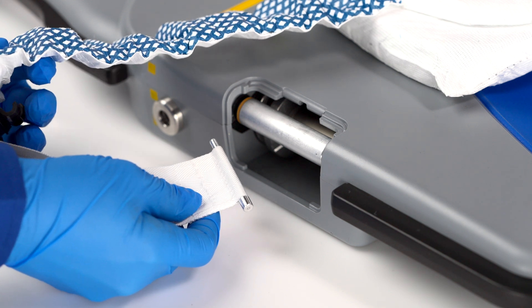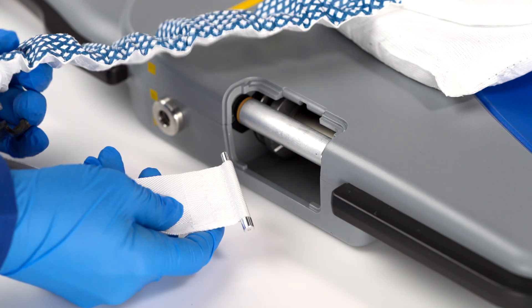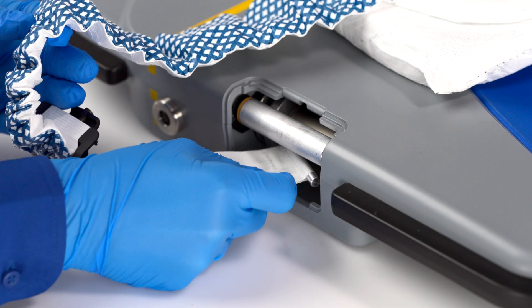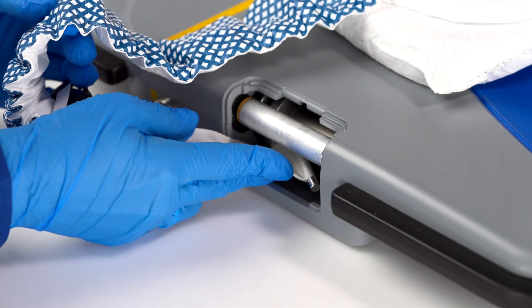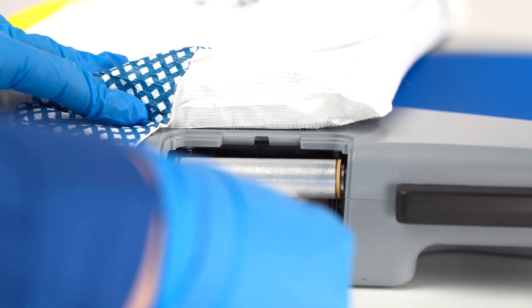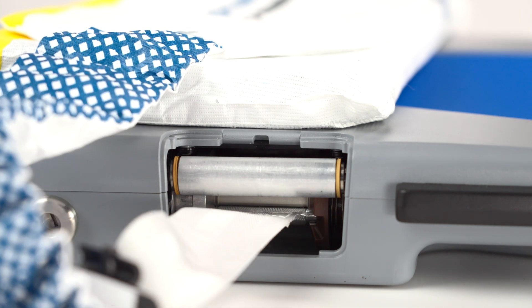Hold the bottom of the band with the small end of the pin facing the yellow line. Insert the small end of the pin into the hole closest to the yellow line. Insert the large end of the pin into the opposite hole. With your fingers under the band, press the pin and snap it into place.